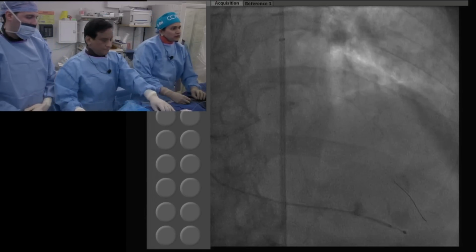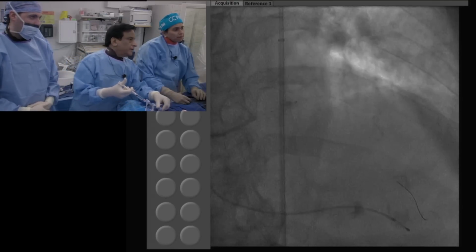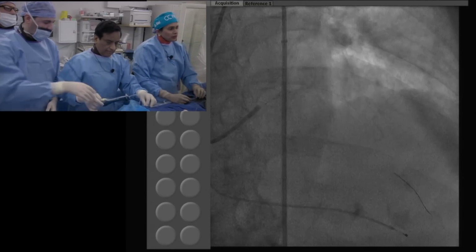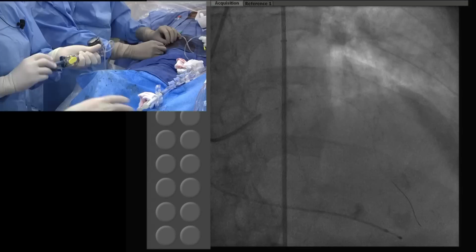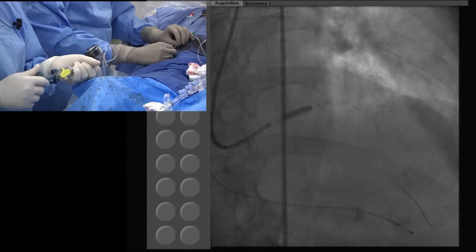See that the dye staining is in the aneurysm, right? It's aneurysm versus distal left main, both. Okay, so go up here. This is a 3.5 by 12. Why didn't you go 4? No, we said we are not. If needed, we will go to the cutting balloon.